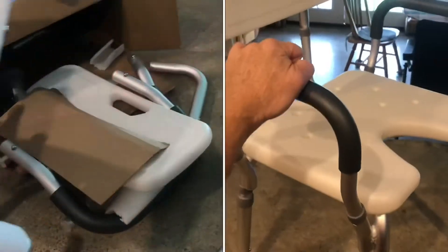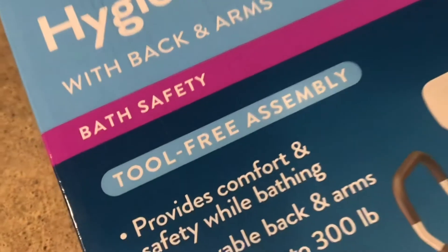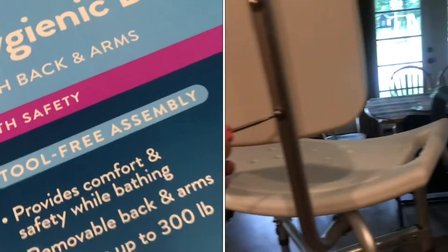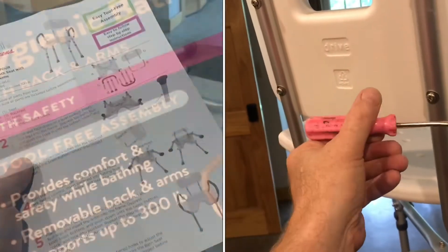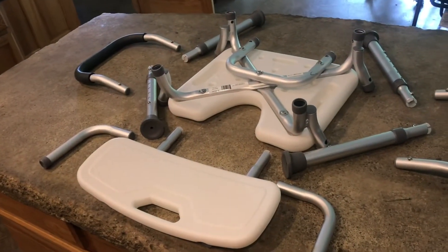Not all bath seats are easy to assemble. This tool-free assembly from Walgreens is easy to assemble. I've put these things together where you have to put in every single screw and bolt. This one comes like this right out of the box — I was so happy to see this compared to the other ones.